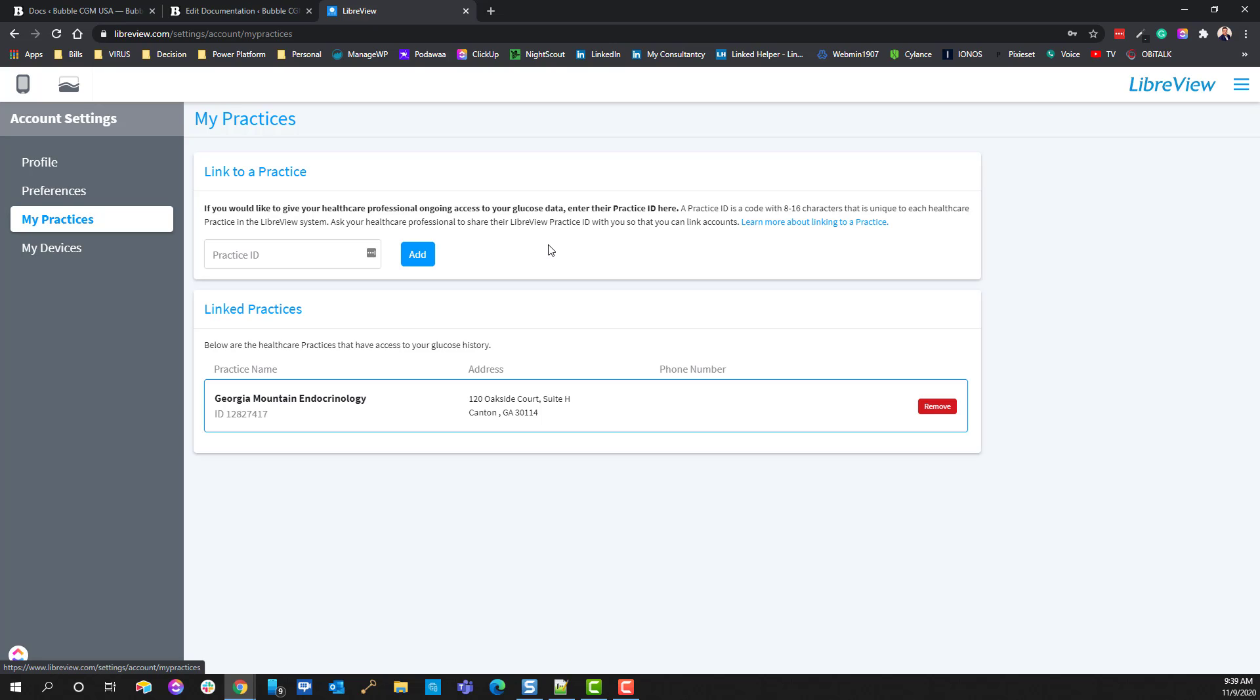This essentially is where you will add your practice ID for your endocrinologist, and they will be able to keep up and see the LibreView reports with you to help you make decisions about your care.